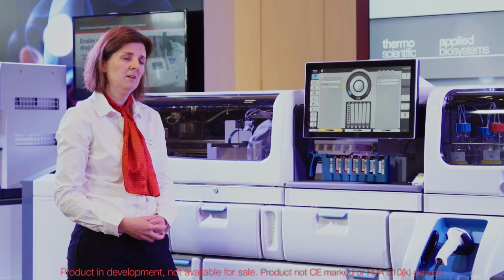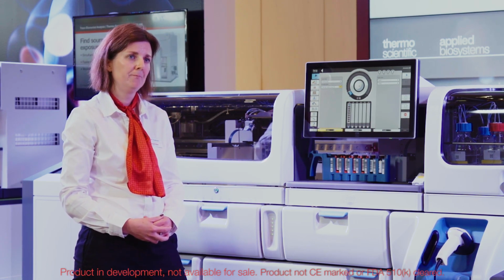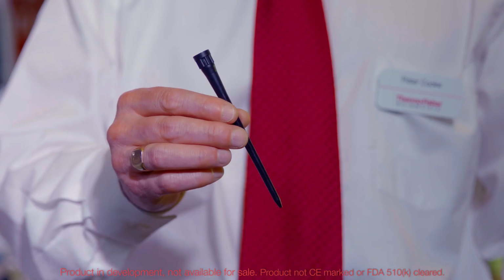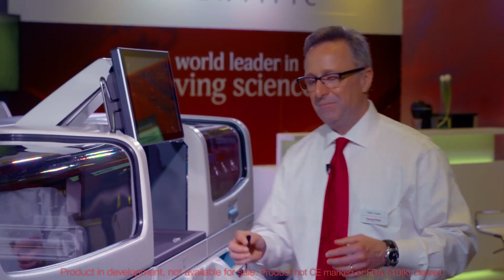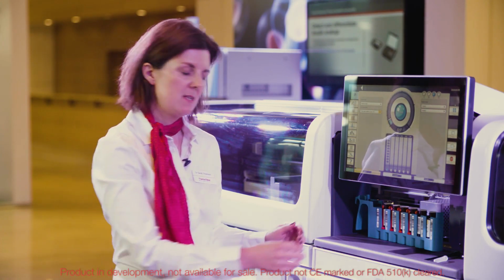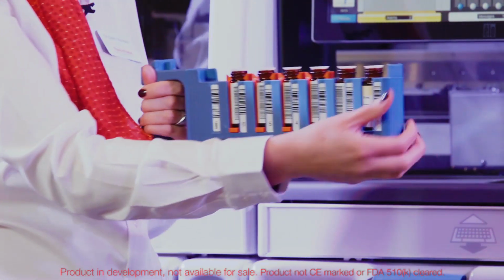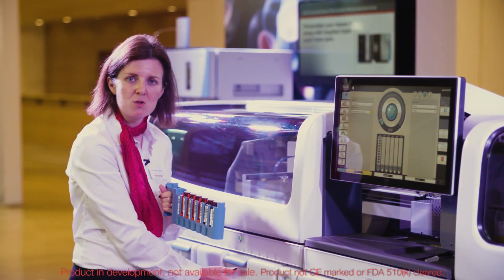The matrices that we're able to work with are whole blood, plasma, and serum. And mixing tips, like this one here, are on board to ensure that whole blood samples are homogeneous for processing. So at this point, the operator would simply press the start button and processing would begin. Once the sample's been dispensed into the extraction vessel, it will take from one of our reagents, which is seen here in the reagent rack, which is positioned into the instrument in the reagent drawer. The reagent will carry out a protein precipitation and at the same time add an isotopically labeled internal standard.